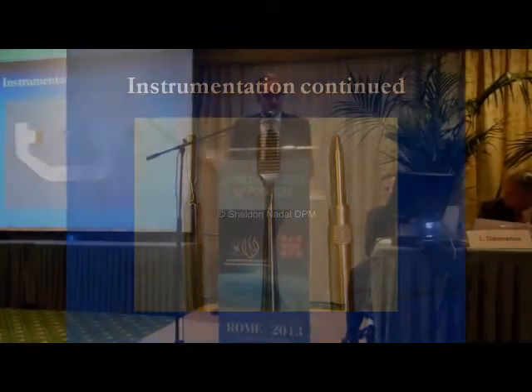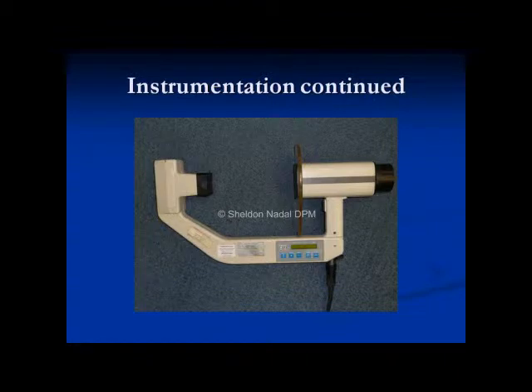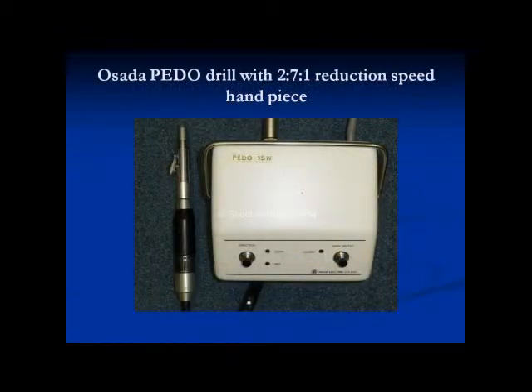This is not a procedure for beginners, and it should be performed with fluoroscopy. This is my handheld fluoroscope from 1986, which, thank goodness, still works. The equipment for performing the osteotomy should be a high-torque, low-speed machine.